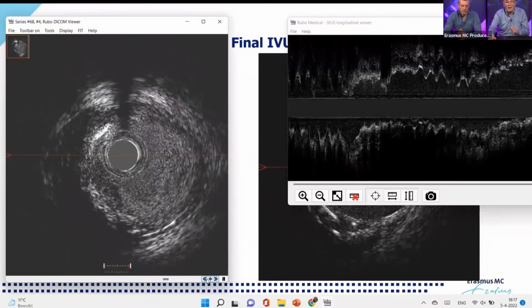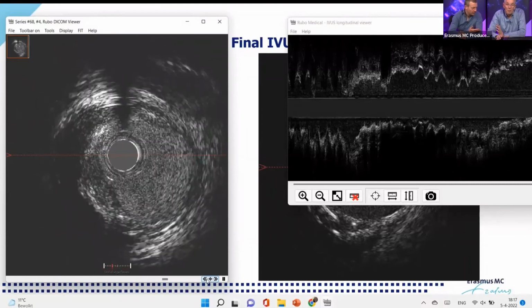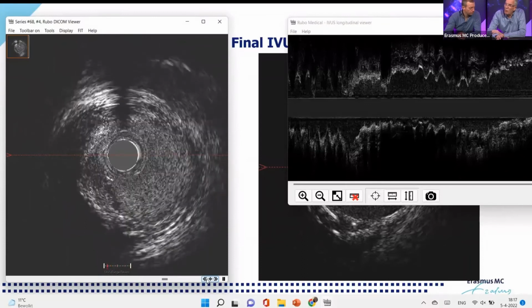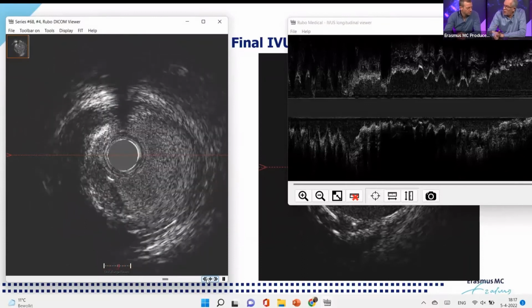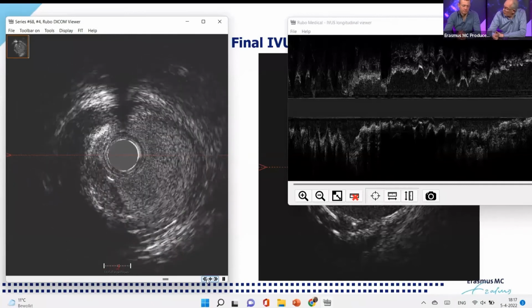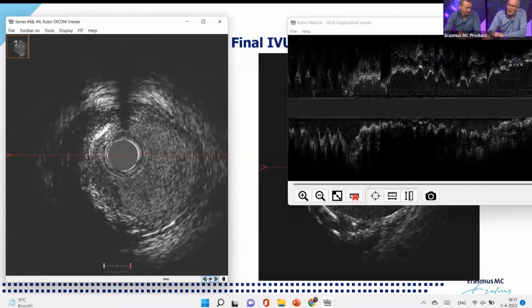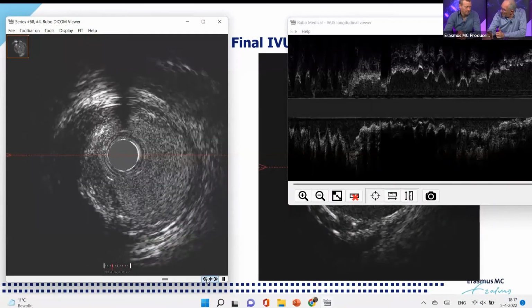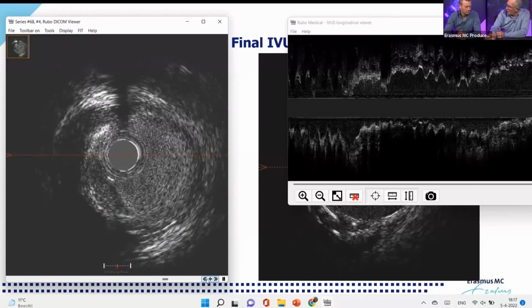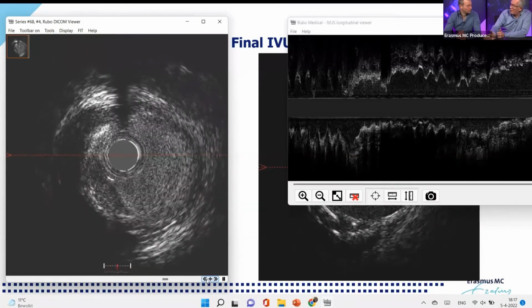So this again, just to remind you, is black. And black is organized. And if you see more white thrombus, more gray, gray-white, I call it subacute, just for the word. But on histology, you see there more fibrin and more red blood cells. Actually, the lines of Zahn we found, the fibrin and the red blood cells, that gives a reflection. But because it's also more homogeneous, it's a little reflection, so it's gray.